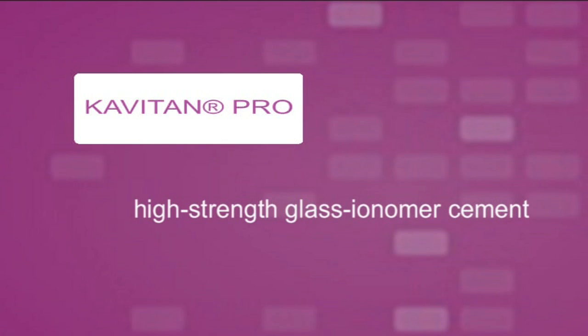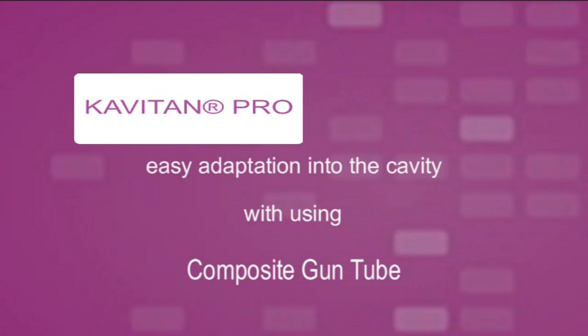Kavitan Pro, a high-strength glass ionomer cement. For easy adaptation into the cavity, it is recommended to use the composite gun tube.